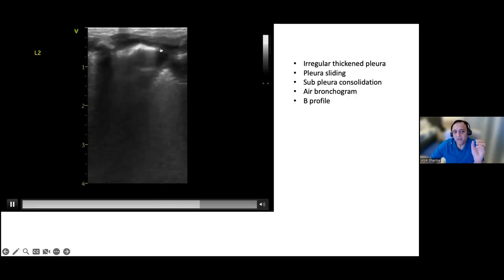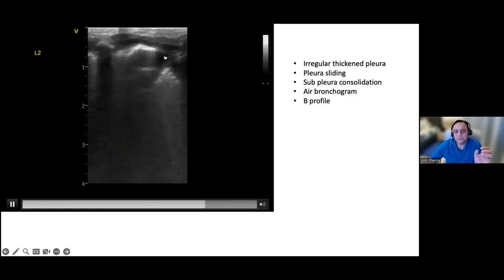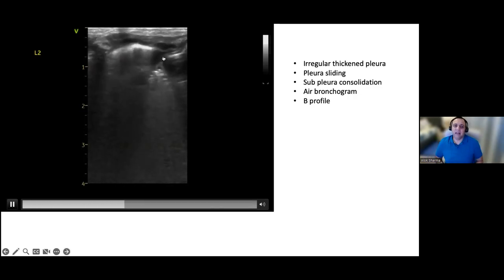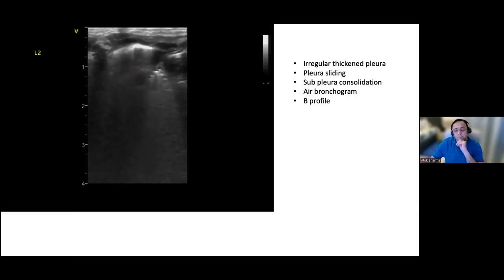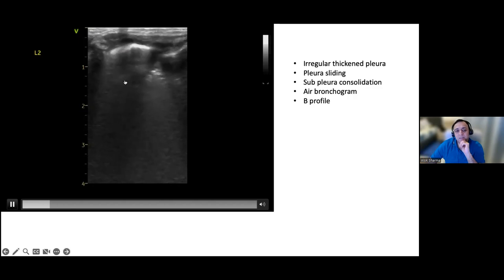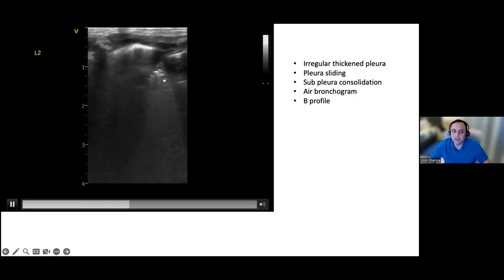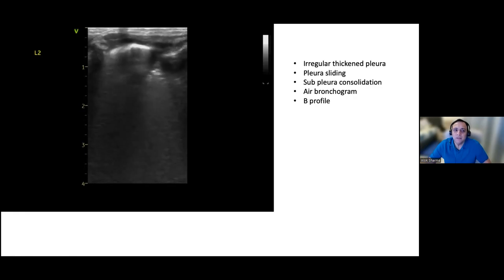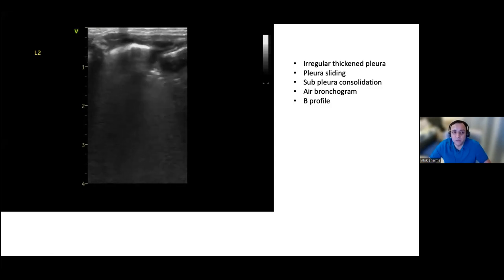But what is very, very important is, I think you also have a little bit of a lung pulse there with the heart. Yeah. And that, again, would favor, I would say, consolidation with a little bit of atelectasis. So it's a beautiful, deep consolidation with a little bit of atelectasis, I think, with static air bronchograms. Pleura is not established just below the rib. And that is classically how a deep consolidation presents. It's a beautiful image. I would save that as part of your portfolio.